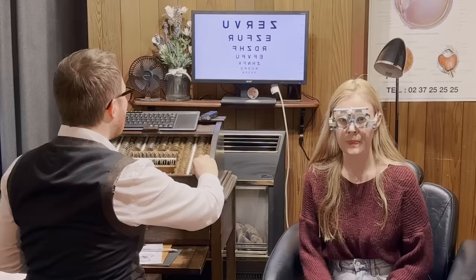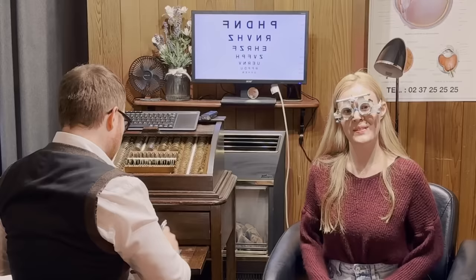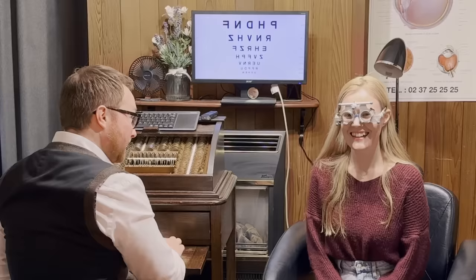Let your eyes get back to normality there. And what's the smallest one you can get there with both eyes together? In the bottom. Yeah. U-B... H-E-N. 5 out of 5. Brilliant. Here we go. So as I say, that's the one better than 20/20 vision. So you're getting a really good level of eyesight there. So that's very good.